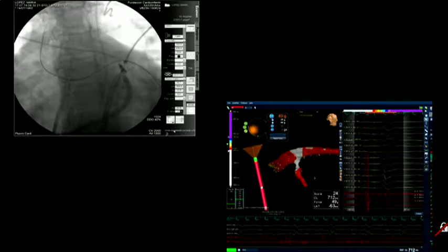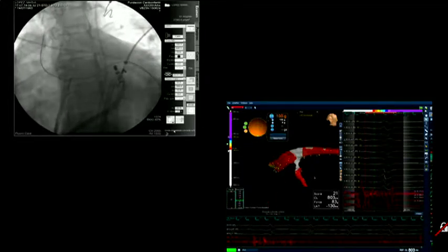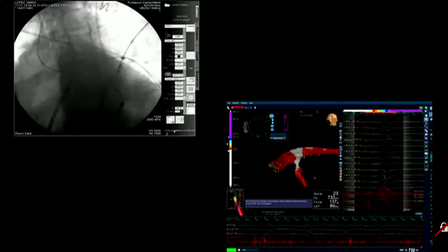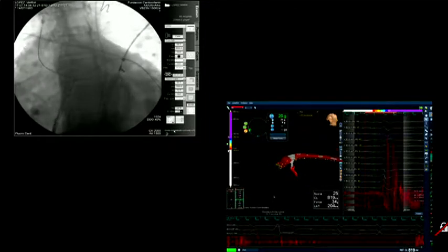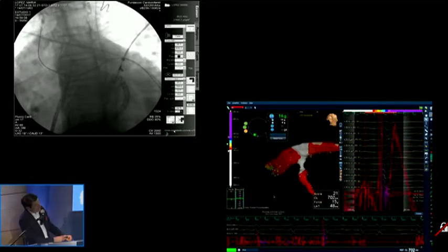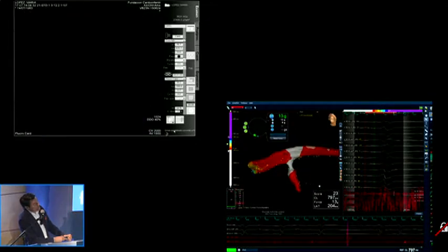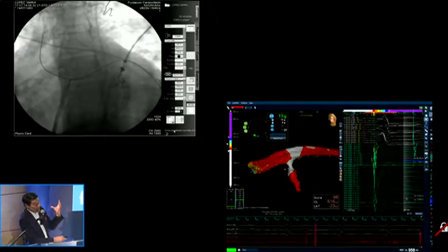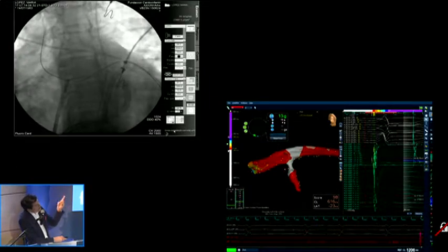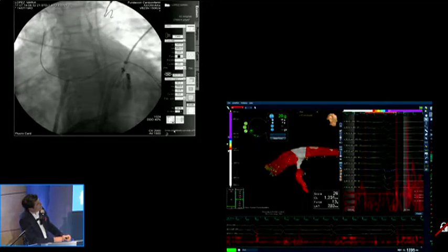No, a 90-degree angle, really. And you need to bear in mind what Dr. Valderrabano is mentioning regarding the rigidity of what you're using. Miguel and Fermin, do you have any experience using a cryocatheter for this area? You know that sometimes it has been proposed as one option because an RF catheter might have very high impedances. But if it is difficult to pass the RF, do you think that the cryocatheter is an option?